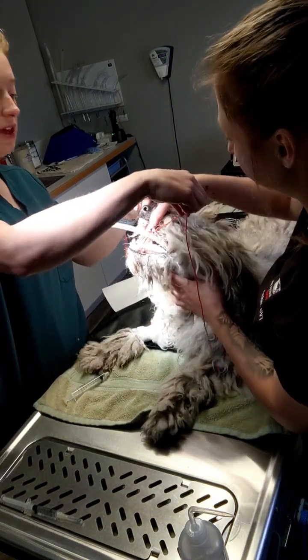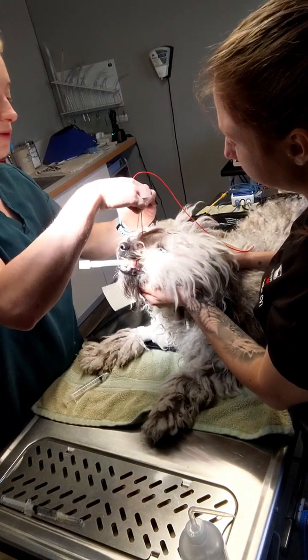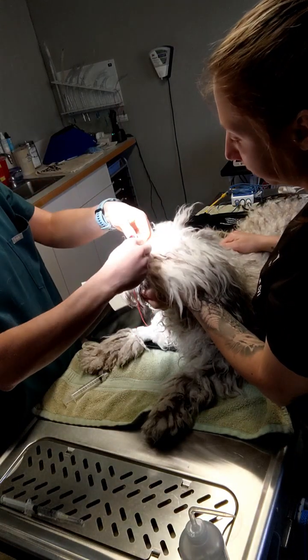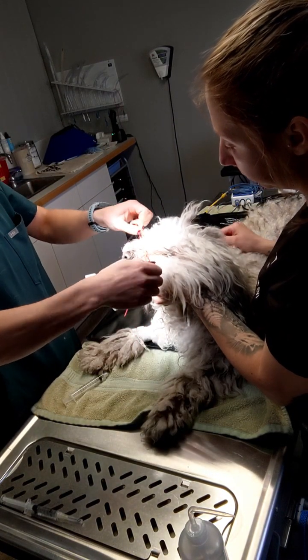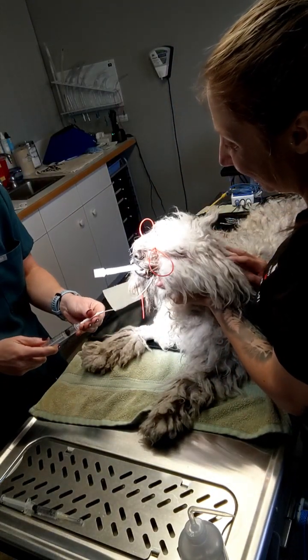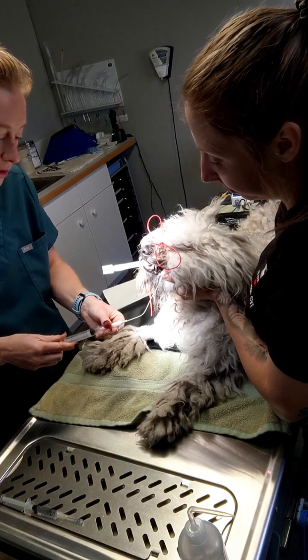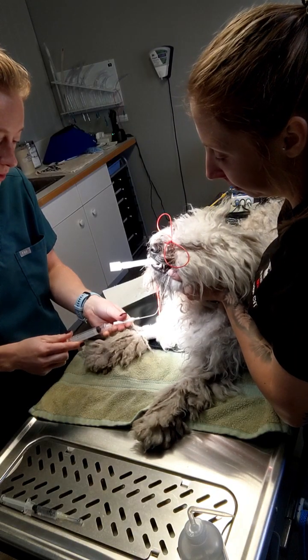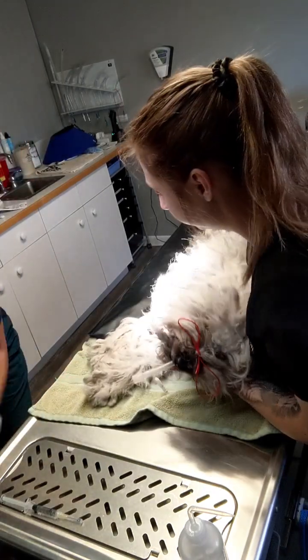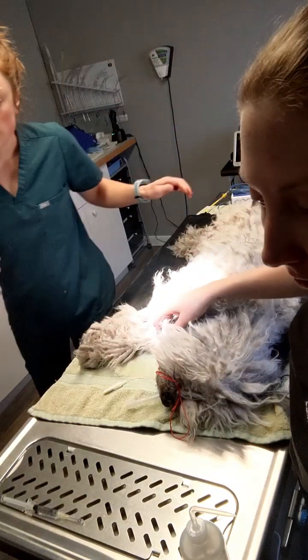Make sure it's tied tightly, and then we like to secure it to the mouth there. Okay, wonderful. I'll go ahead and inflate the cuff. Okay. Go ahead and get her hooked up to our anesthesia machine.